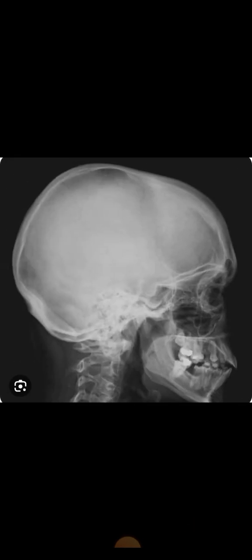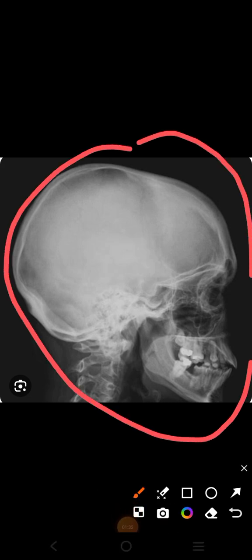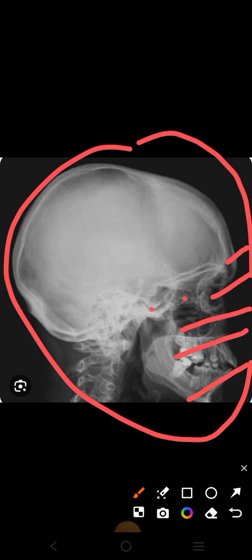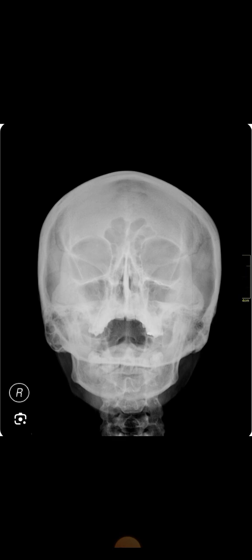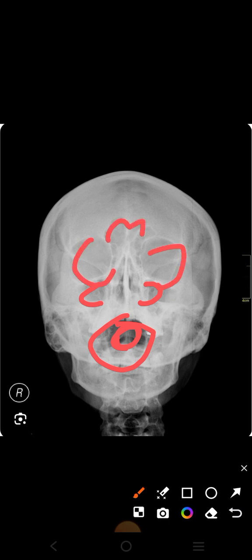This is the lateral view. In this view you can see the orbits, frontal sinus, maxillary sinus, upper jaw, lower jaw, and also the sphenoidal sinus - mainly the extent of the sphenoidal sinus. Above it is the sella turcica. The patient's mouth is open in this x-ray because you want to see the sphenoidal sinus. You can also see the maxillary sinuses, orbit, frontal sinuses, ethmoidal sinus, and nasal septum.